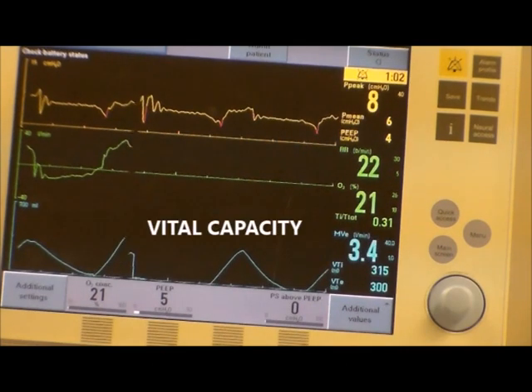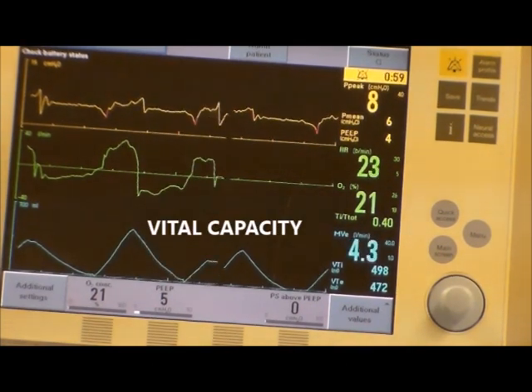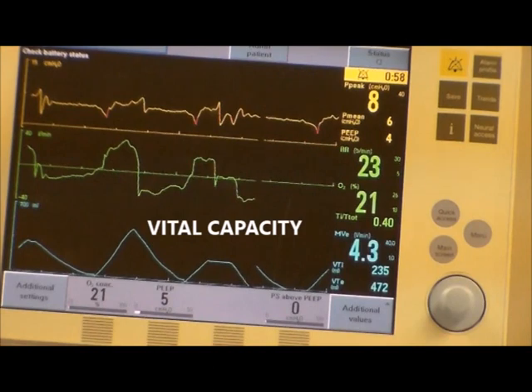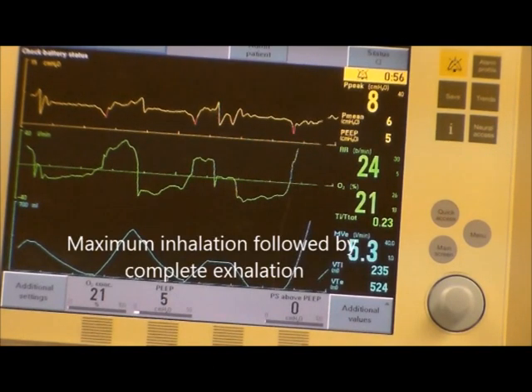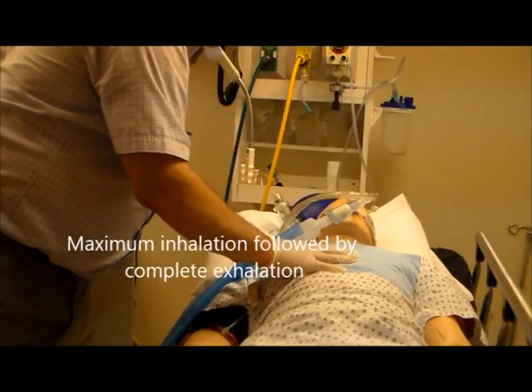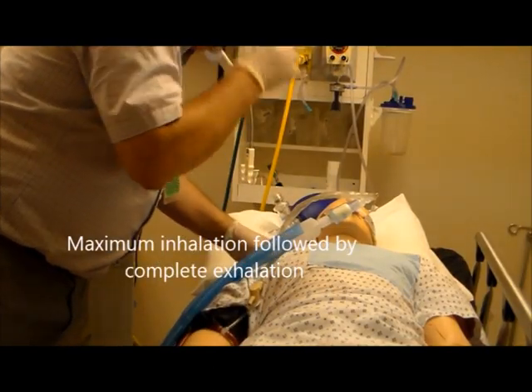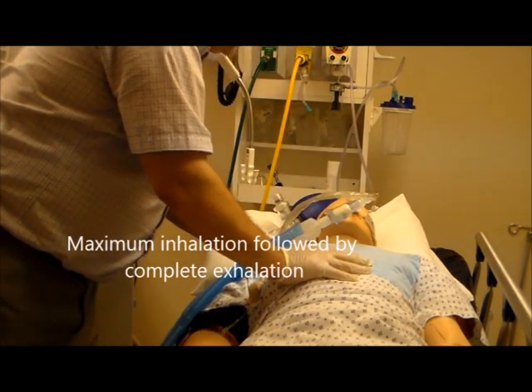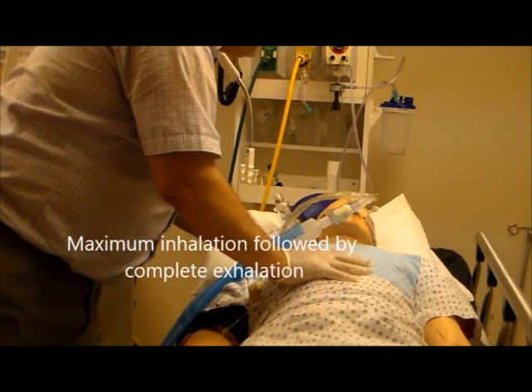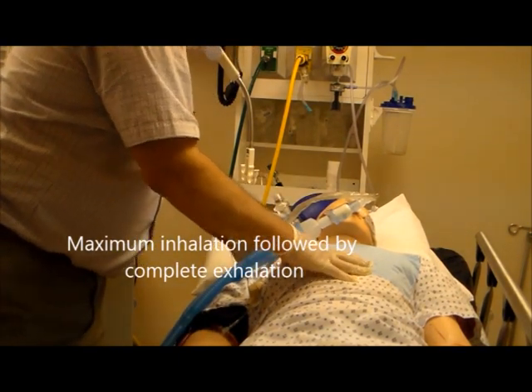For vital capacity, you're going to instruct your patient to take a real big breath in and blow it all the way out. Mr. Smith, I'm going to have you take in a great big deep breath and blow it all out. Big breath in.